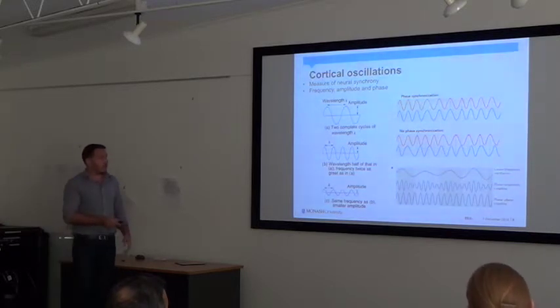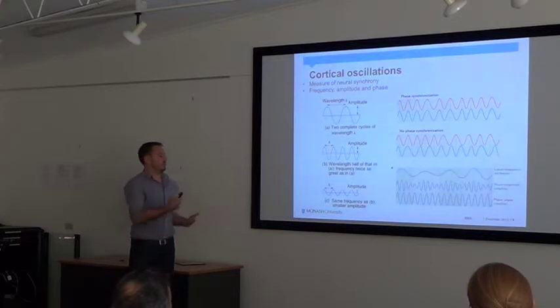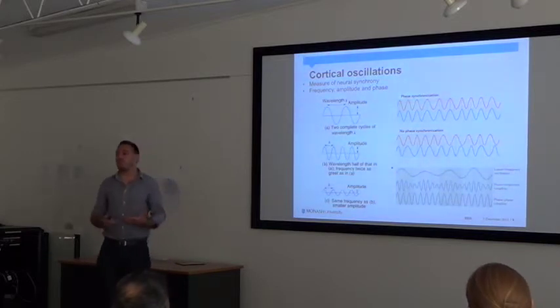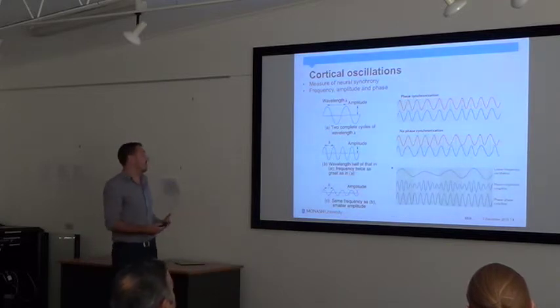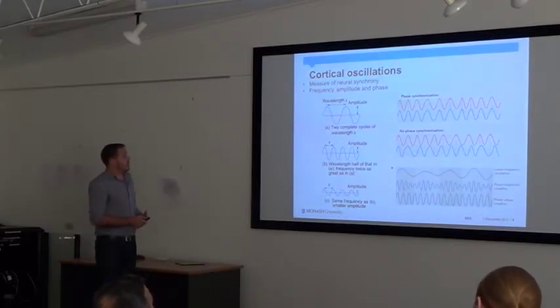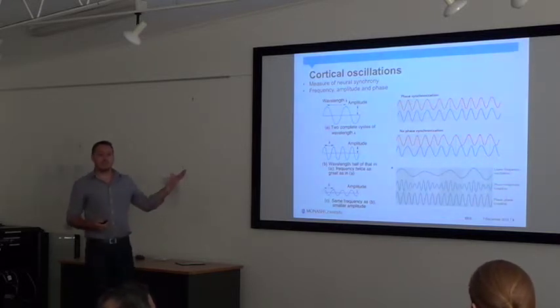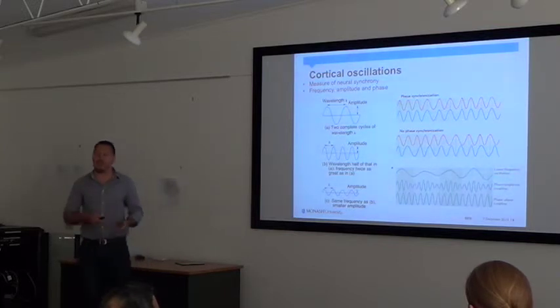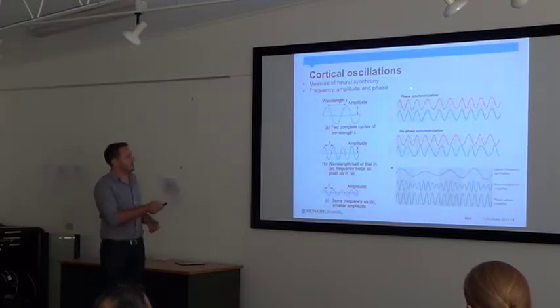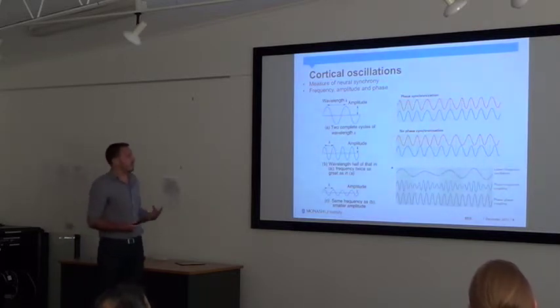Okay, so as we saw, we got these nice squiggly lines across the scalp, and we've successfully recorded an EEG recording. But what does it actually mean? What kind of information can we drag out from this? So generally we get these oscillations that we saw earlier when we saw those EEG traces, Hans Berger's alpha wave. We get these oscillations that just head across the brain. So generally what we're measuring when we're measuring from EEG is three main things.